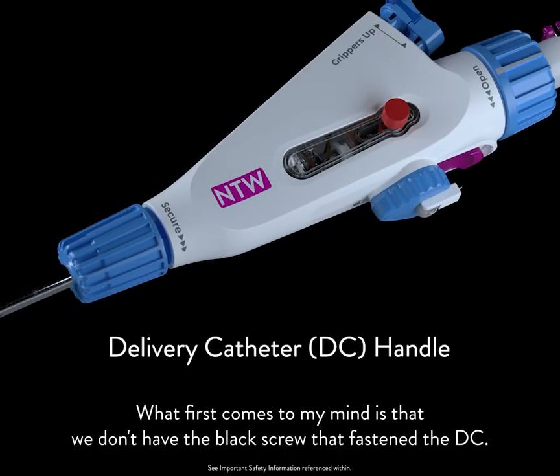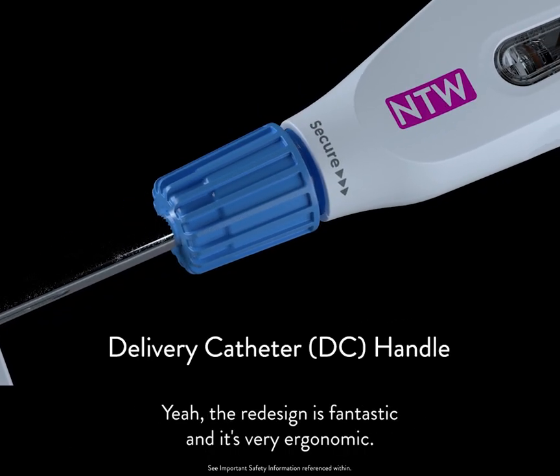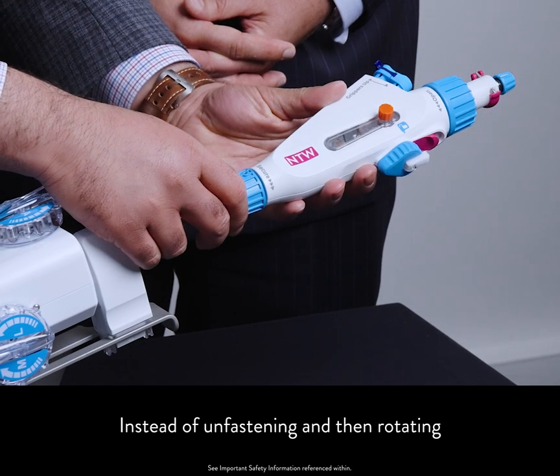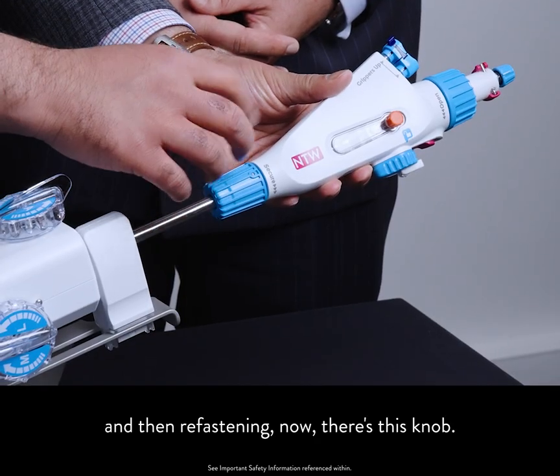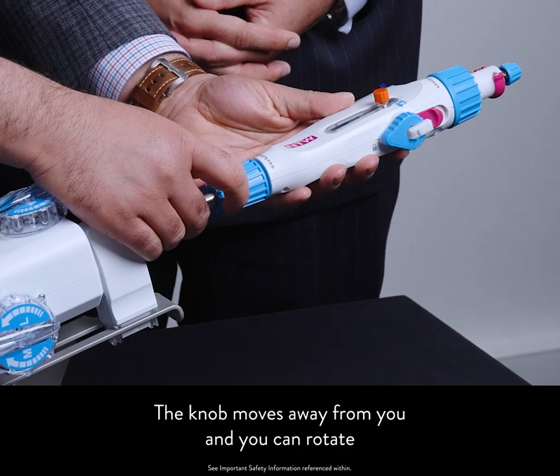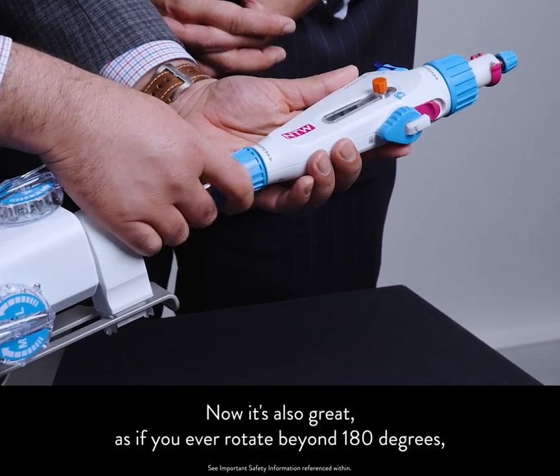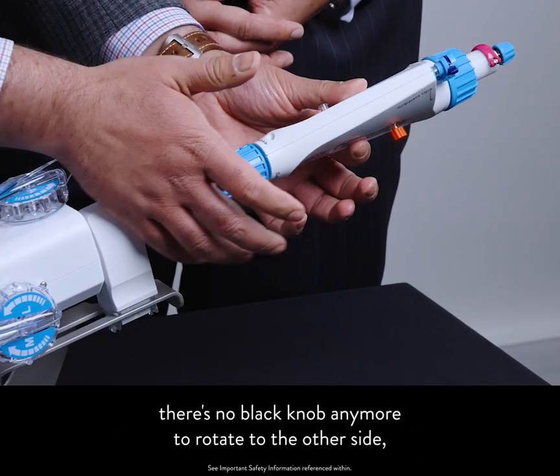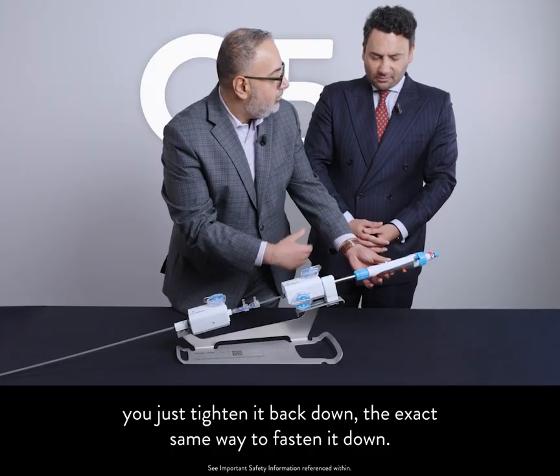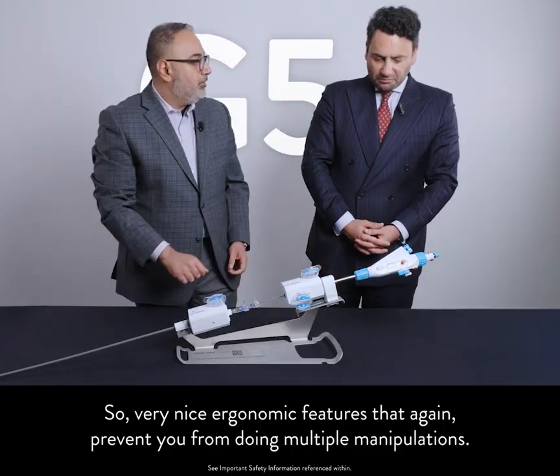Now let's focus on the DC handle that has been completely redesigned. What first comes to mind is that we don't have the black screw that fastens the DC. The redesign is fantastic and very ergonomic. Instead of unfastening, rotating, and refastening, there's now this knob. The knob moves away from you and you can rotate, then refasten by rotating it towards you. If you ever rotate beyond 180 degrees, there's no black knob anymore — you just tighten it back down the exact same way. Very nice ergonomic features that prevent you from doing multiple manipulations.